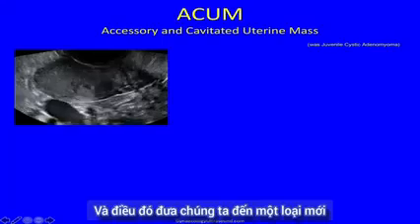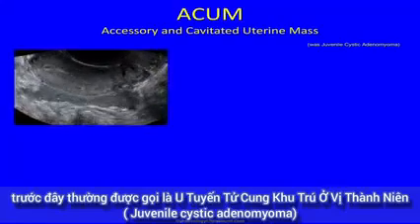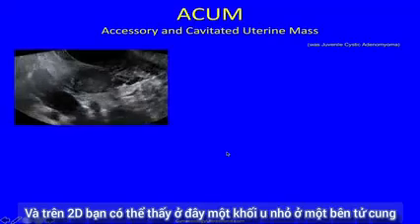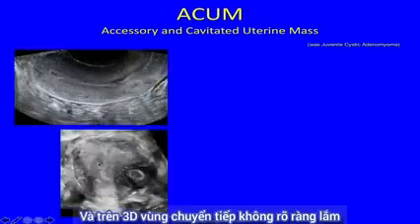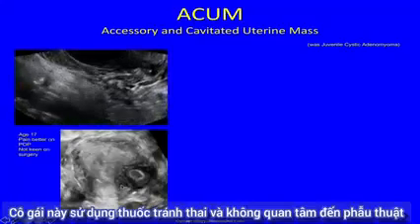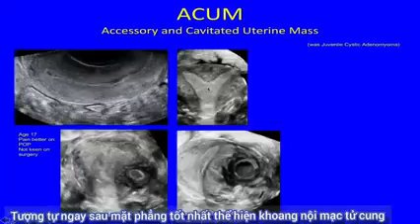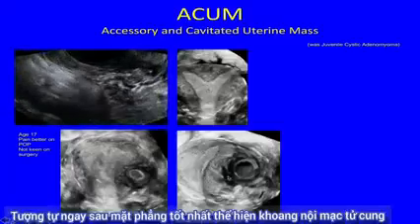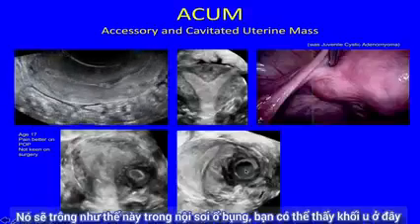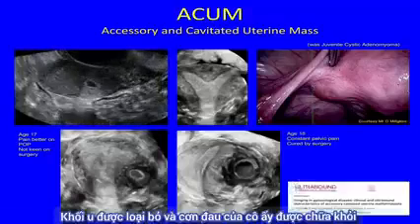That takes us on to a new entity called accessory and cavitated uterine mass (ACUM), which used to be called juvenile cystic adenomyoma. This is a 17-year-old girl with intense dysmenorrhea. On 2D you can see there's a little mass over to one side of the uterus, and on 3D it's slightly indistinct but this is a normal-shaped cavity, with just slightly behind that plane this little mass. This girl went on the mini pill and wasn't keen on surgery. As opposed to an 18-year-old who has a slightly arcuate uterus and a cystic mass in the myometrium with internal hemorrhage — this is what that looks like at laparoscopy. This patient had opted for surgery, it was removed, and her pain was cured.